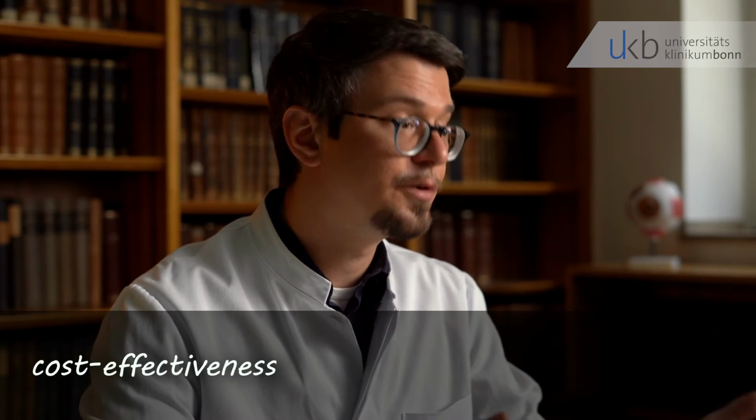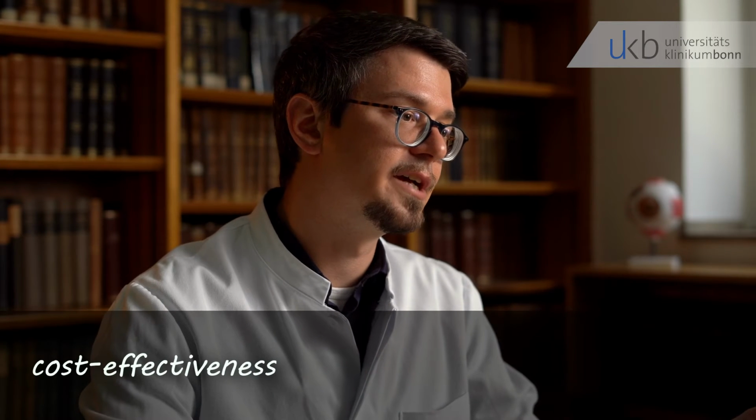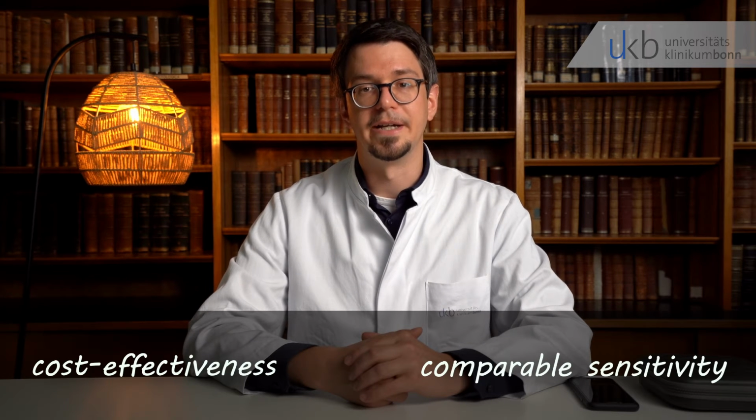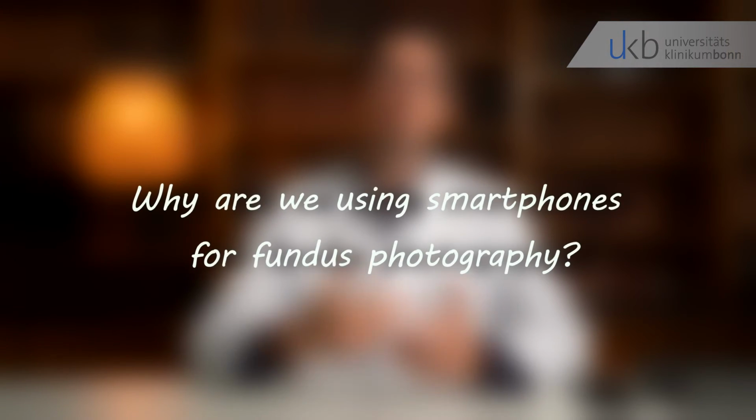Beneficial aspects of the telemedical setting are the higher cost effectiveness compared to a setting where the doctor needs to travel to the camp her or himself. If the examination is thoroughly performed, it is also comparable to a normal eye examination in terms of sensitivity to detect diabetic retinopathy. So why are we using smartphones for fundus photography?